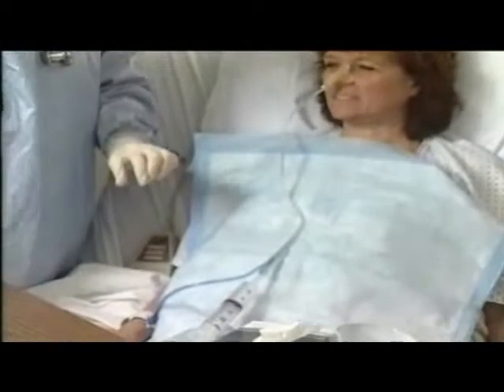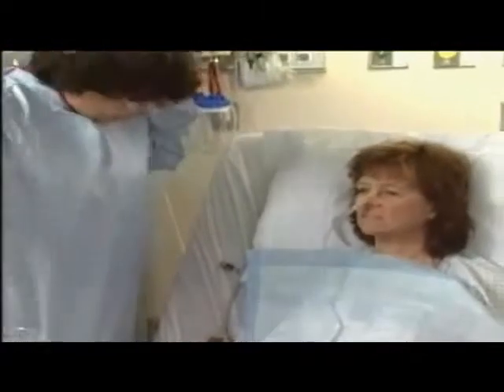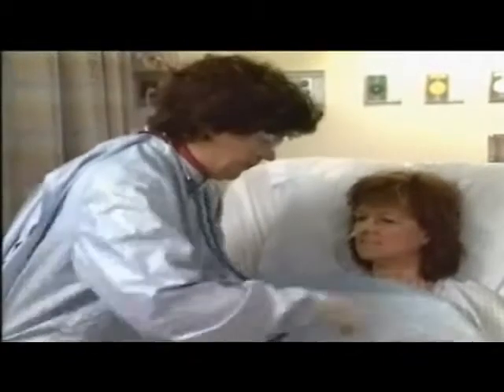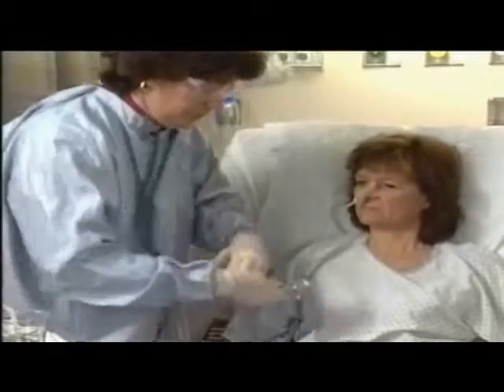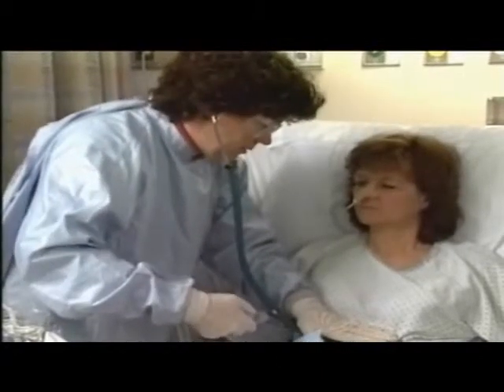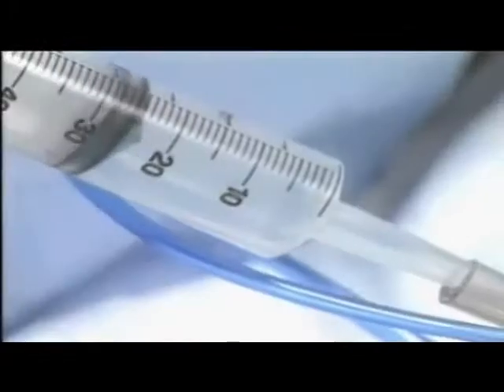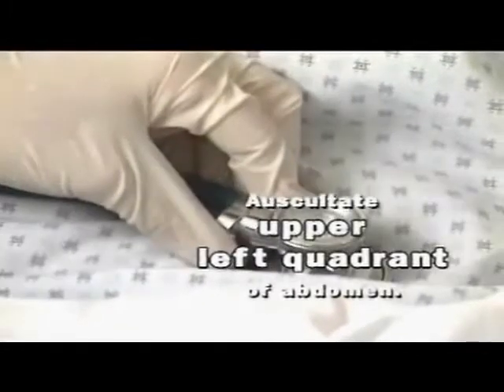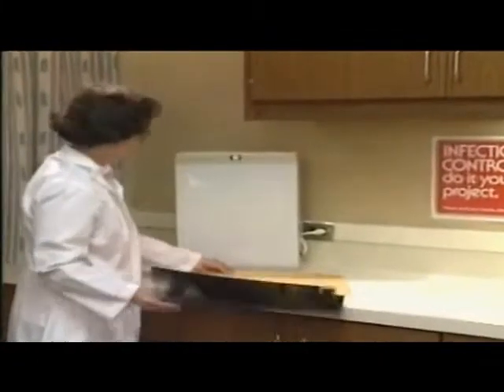Check the tube for placement. Attach a catheter tip syringe to the end of the tube. Ask the patient to talk — if the patient is unable to talk, the tube may have passed through the vocal cords. Inspect the back of the mouth and posterior pharynx for a coiled tube, as a soft tube may coil rather than advancing down the esophagus. Insert 20 to 30 milliliters of air while auscultating the upper left quadrant of the abdomen; a whoosh or gurgling sound may indicate correct placement.